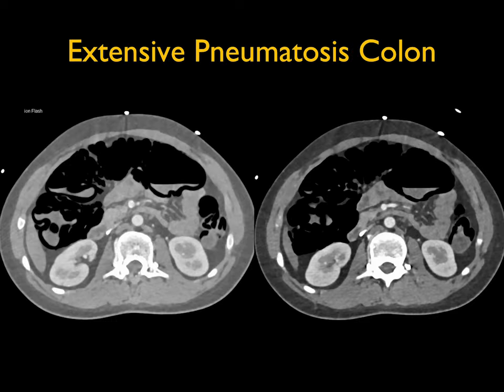Case three — we see pneumatosis. Whenever you think of pneumatosis, be it small or large bowel, you're thinking of ischemia. Not every case of pneumatosis is ischemia, but it's a very important diagnosis because pneumatosis is associated with ischemic bowel, which can be a surgical emergency. Many things — benign diseases as well as medications like steroids — can be the cause of pneumatosis.